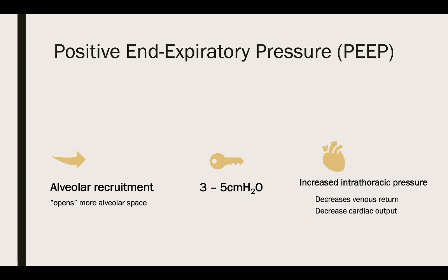You can leave it at 2, you can leave it at 3. Usually we start it at 3, just to give you a little bit extra, a little bit of support. If your patient does have some underlying respiratory issue, you probably need to start setting it at 5 and go up from there. We can go pretty high.